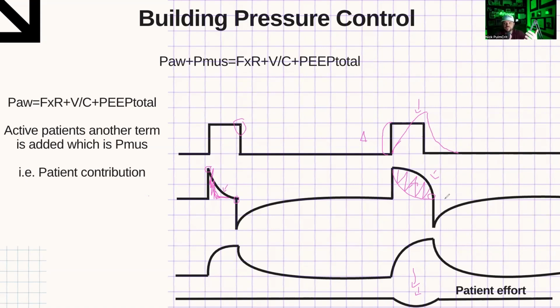So if you have someone on the vent and they have ARDS, and you want to do some low tidal volume strategy, and they have a tremendous drive to breathe, and they're pulling all this extra flow and volume, but you don't know, and you set the vent, you set the PEEP of 10, and you make the inspiratory pressure 15. So you think, wow, okay, the plateau isn't going to go above 25. If the curve looks like that, you don't know what the plateau is, and it's more than likely above 25. So in the subsequent breath, if you did a breath hold, you would get the plateau and it would be higher. And that's not good for anyone.